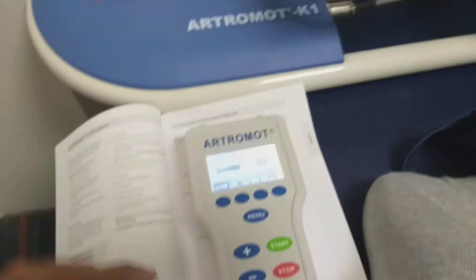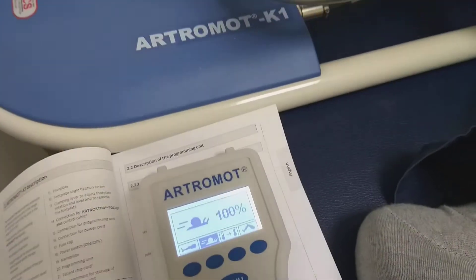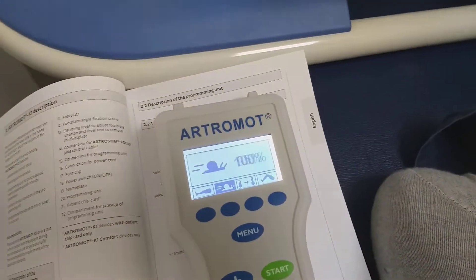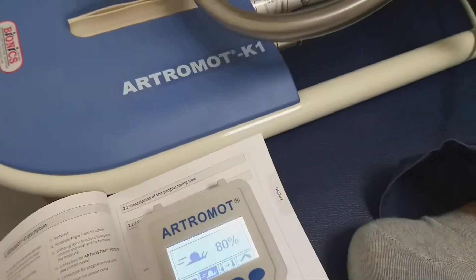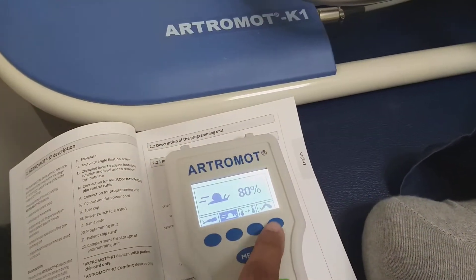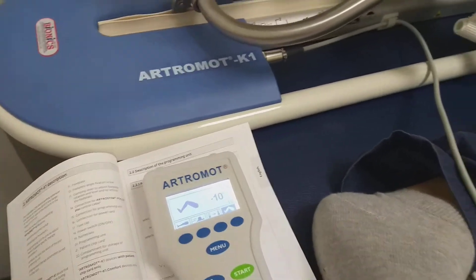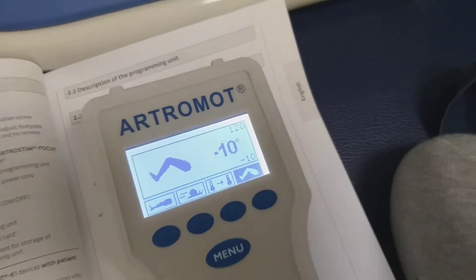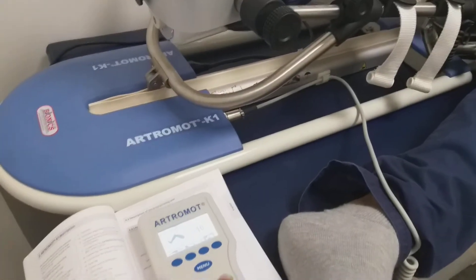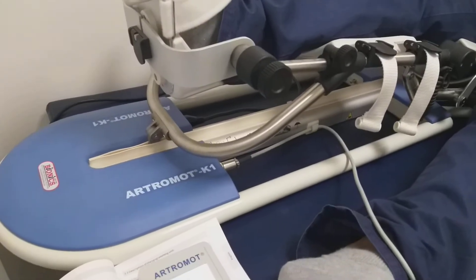Now we start. Here you can change the speed. Here you can press and fix the extension angle. Now I am starting from minus 10 to 120 degrees. Press the start button and the machine will start.